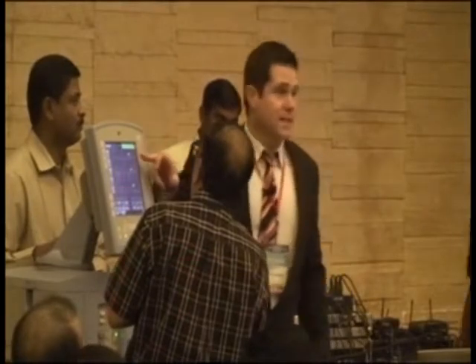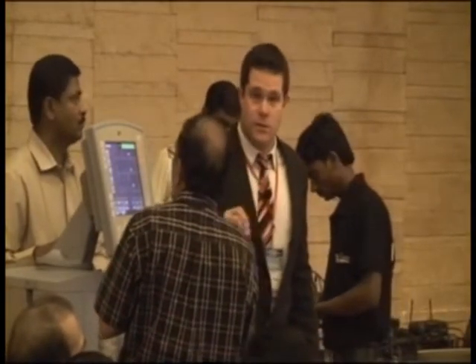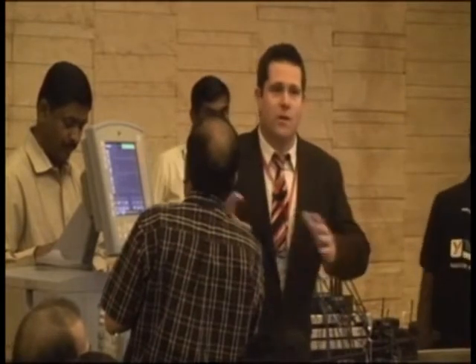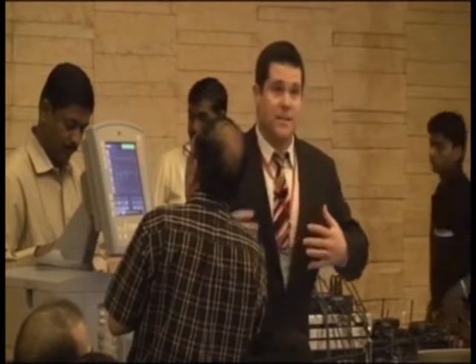So it went from 26 down to 20. So we're getting there, right? We're getting closer, right? Now, what are some other things that we could be doing right now? I know you all want to wean that rate, and I agree with you 100%. But there are other things going on. This patient's sick.